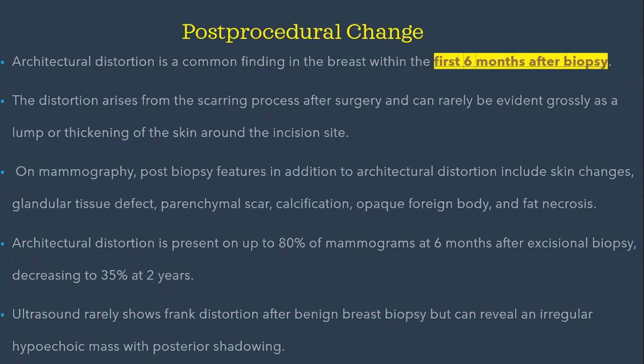Architectural distortion is present on up to 80% of mammograms at 6 months post-excisional biopsy, decreasing then to 35% at 2 years and so forth. Okay.